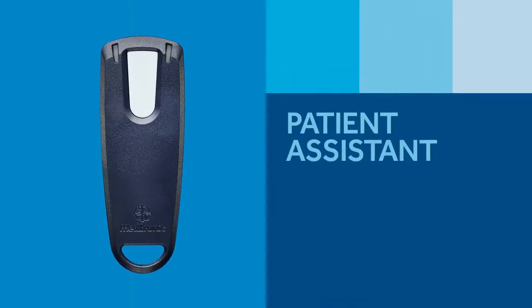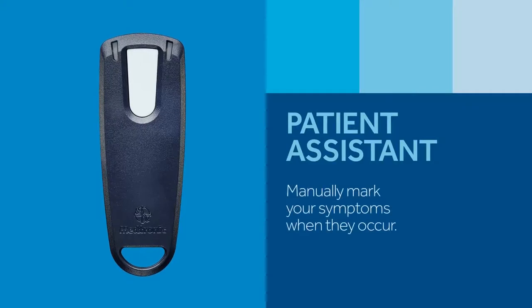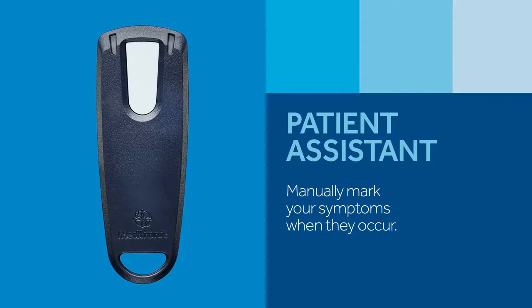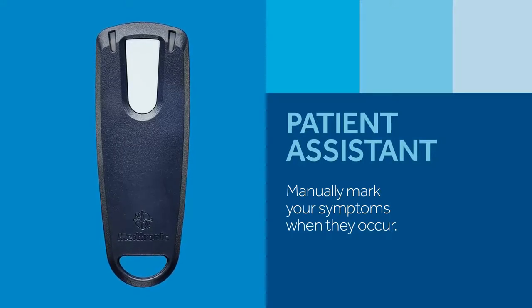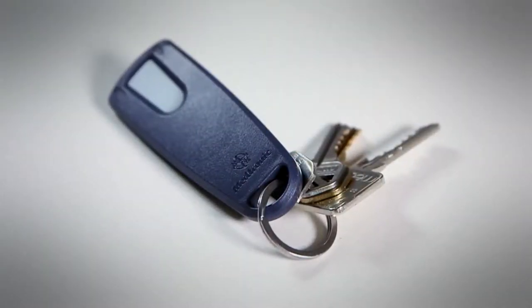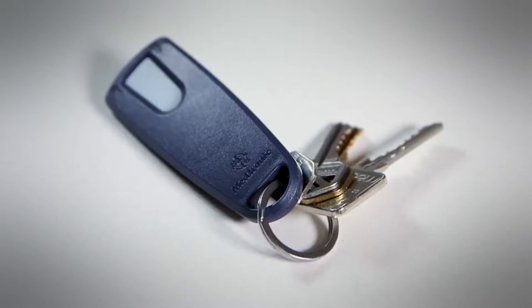Depending on your symptoms and the reason for your heart monitoring, your doctor may provide you with a Patient Assistant. This small handheld device allows you to mark your symptoms in your Reveal LINQ ICM when you feel them, such as dizziness, fainting, or palpitations. Later, your doctor will be able to view what your heart was doing at the time your symptoms occurred. If you received one, carry it with you at all times so you have it handy in case you experience a symptom. When you feel a symptom, you'll have about five minutes to mark it with the Patient Assistant. Otherwise, just write down the day and time of your episode to share with your doctor later.